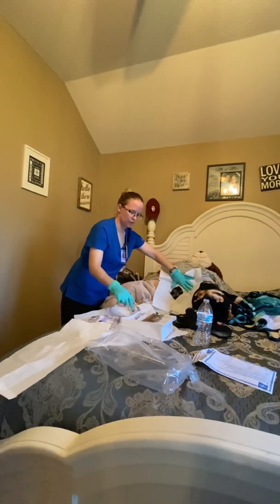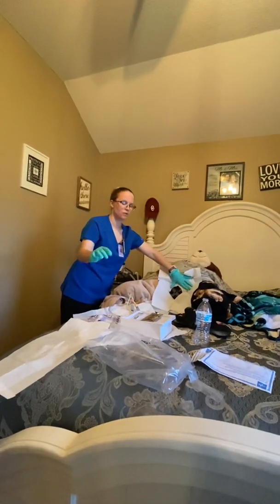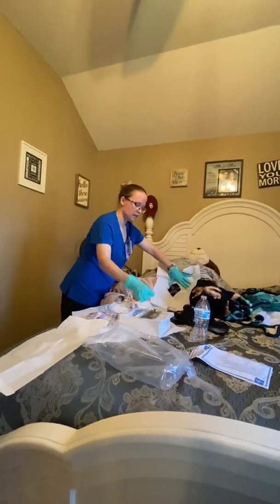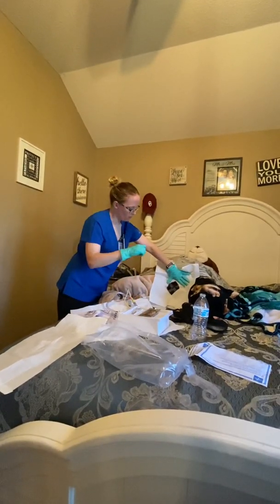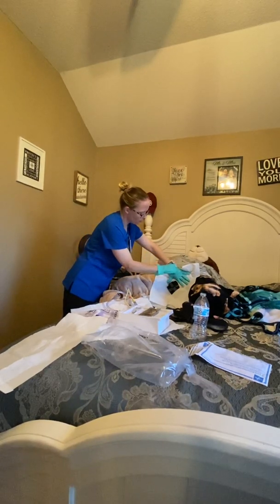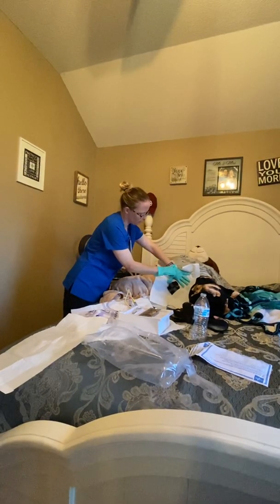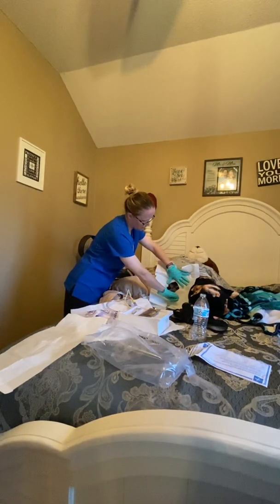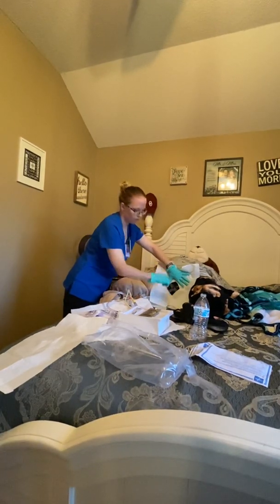Before we do that, we're going to clean it. We're going to get a swab stick. We're going to clean from the side that's close to us, from the clitoris down to the rectum. That's the first one, and you're going to discard it.